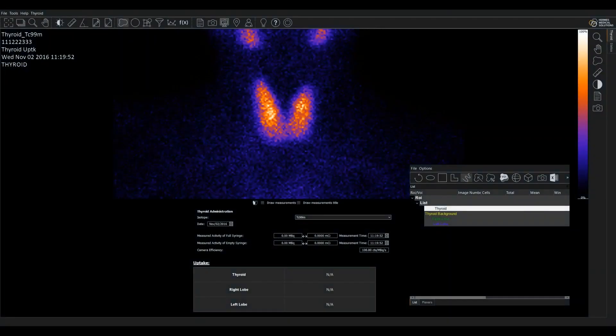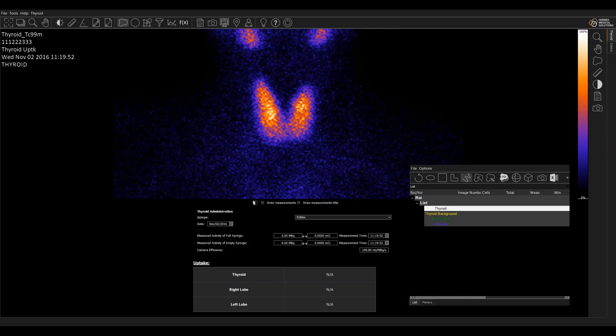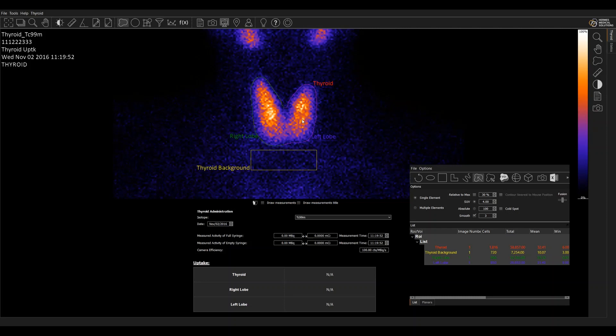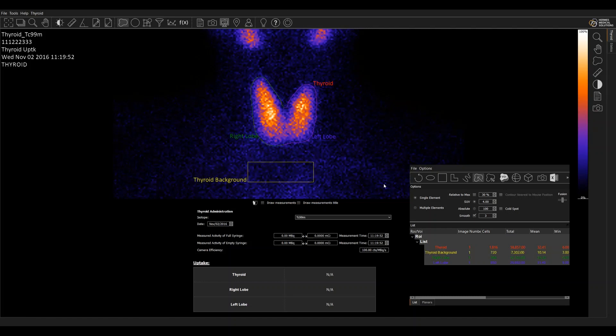Looking at the application, we have here a region for the thyroid. I'm just going to use a seed ROI. So click and drag to nicely get an outline of the thyroid there. The system automatically halves that to make a left and a right lobe. They can be redrawn if they are not right. Thyroid background is automatically placed. Again, that can be redrawn or moved very easily if it's not correct.